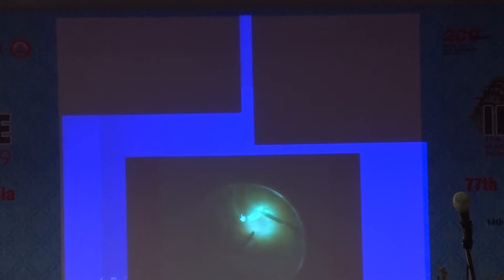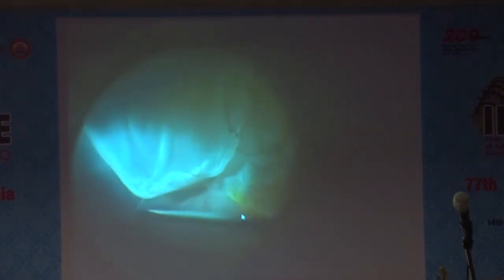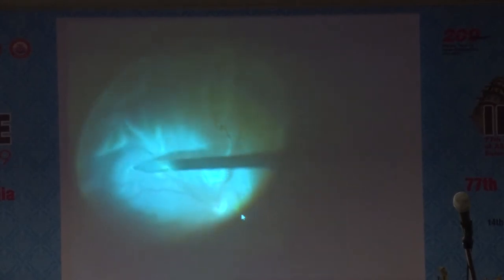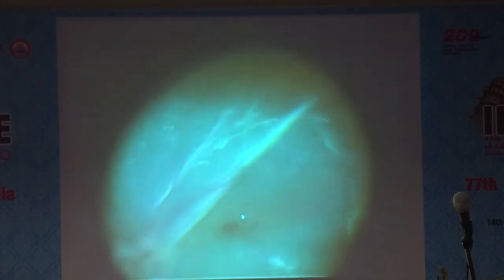Mostly you tend to go tangentially towards the periphery, but at times you need to do a little bit of manipulation. And I think the problem is here. Now, this is a very tough kind of hyaloid here, and it is coming only partly. And despite MVR being used, this is a little dated kind of surgery which I'm showing. And in this case, triamcinolone will help you.